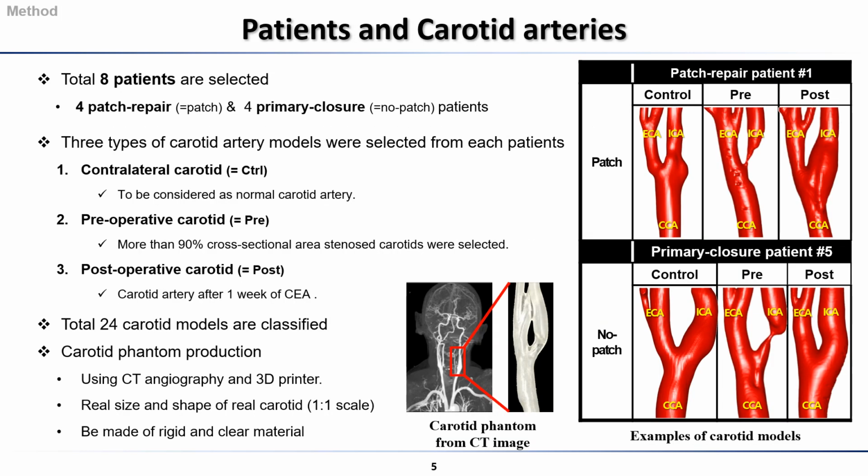First, for this study, we selected 8 patients who underwent endarterectomy for atherosclerosis. These 8 patients were classified by the closure method. 4 patients were patch-filled, and the other 4 were primary closures.